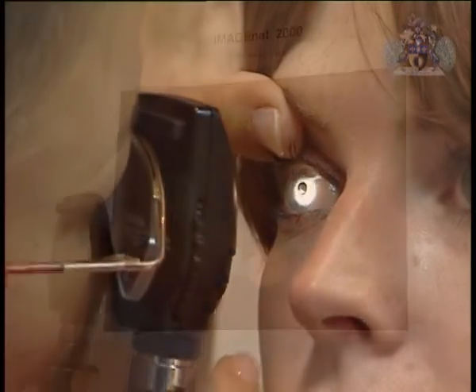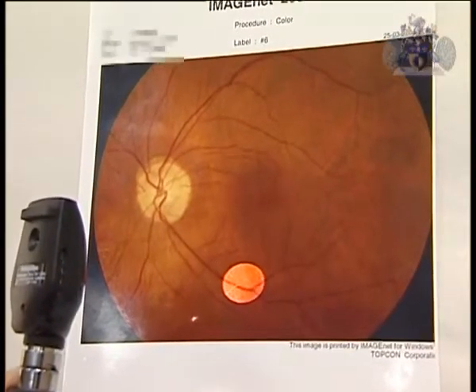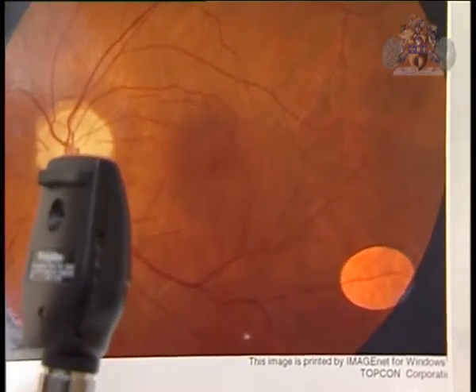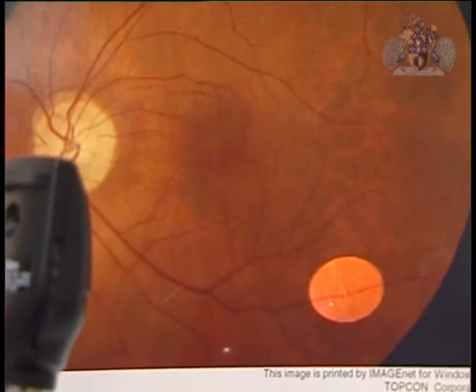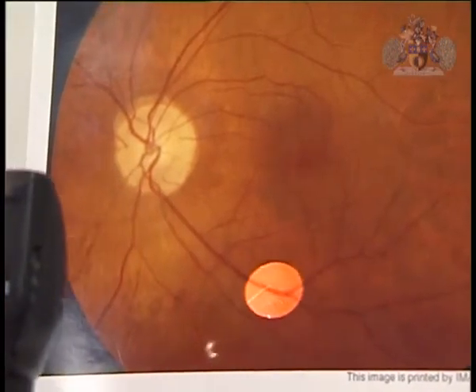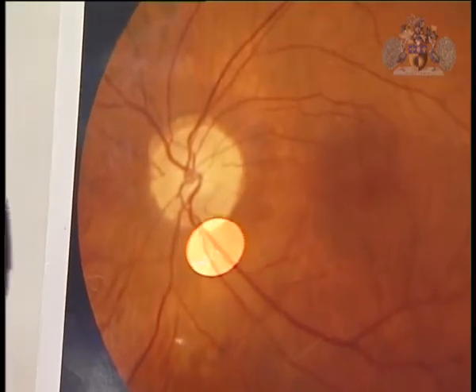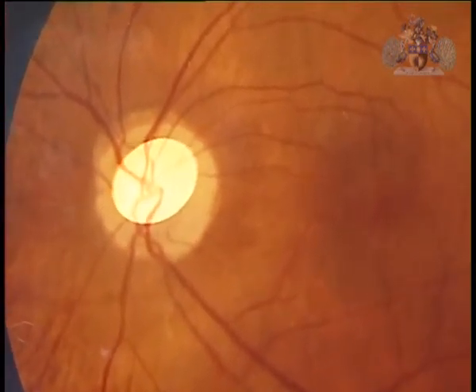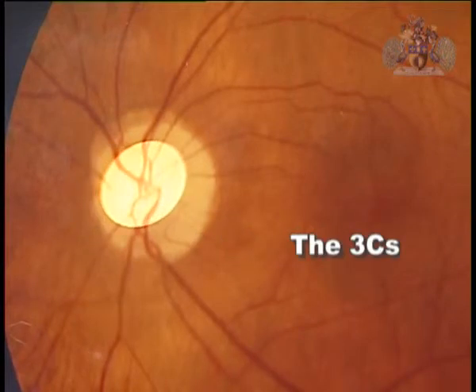Find a blood vessel and follow it. All blood vessels lead to the optic disc. If you have followed it and not found the disc, go back in the other direction. Find the optic disc. This is nasal. Once you have found the optic disc, you need to describe 3 things about the disc. The 3 C's: cup, colour, contour.